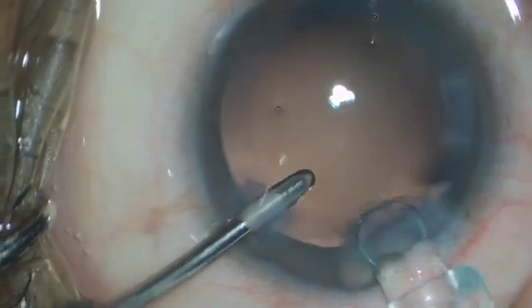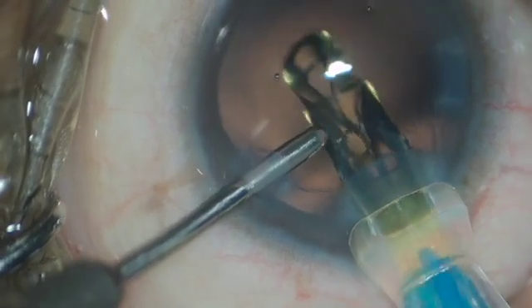Again, we keep our finger at the tip of the nozzle to maintain pressure and start injecting the IOL very slowly. This time, the leading haptic will come in a folded way and we can happily inject it.